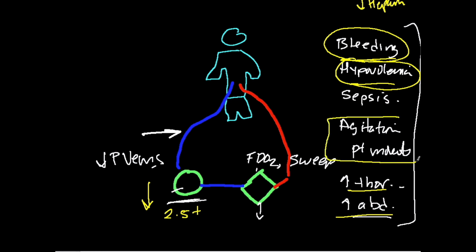Agitation and patient movement can be a little bit crazy. Obviously, we desire our patients to be awake and interactive, but sometimes that's just impossible. Sometimes them having a higher metabolic rate when being active, just random movements, can create huge problems with the flows. And draconian as it is, sometimes we just have to sedate these people really deeply and even paralyze them just to be able to create an upper hand and let the machine keep the body afloat while the rest of the parts are healing.